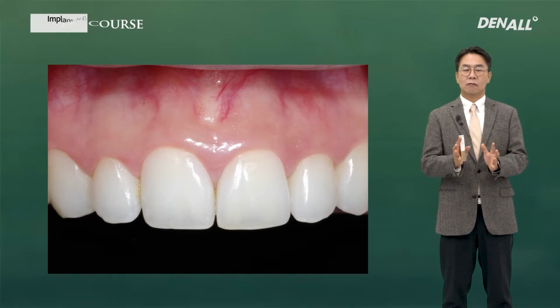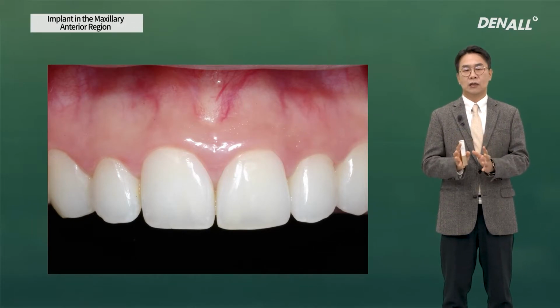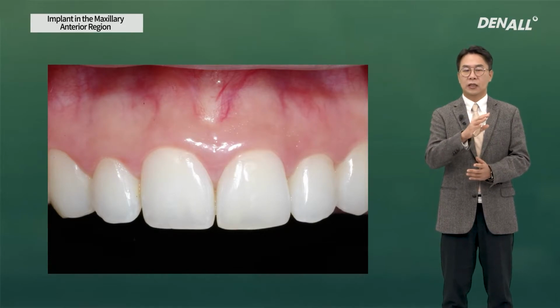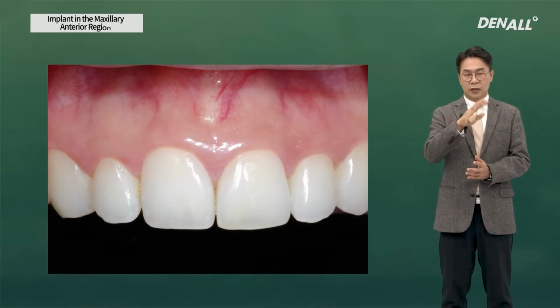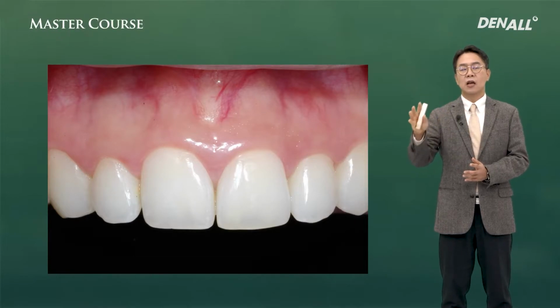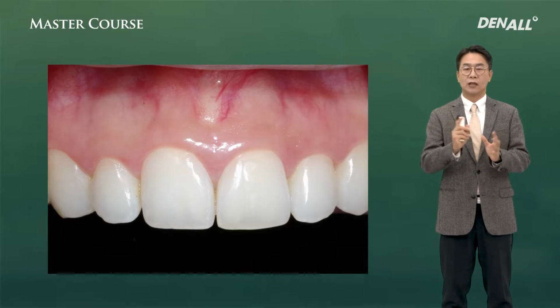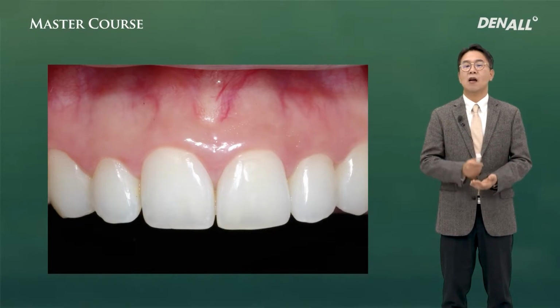When gingiva is very healthy and the teeth look squared, we need to look at the teeth and the gingiva. The gingiva contour looks very natural and the interdental papilla area is fully filled.